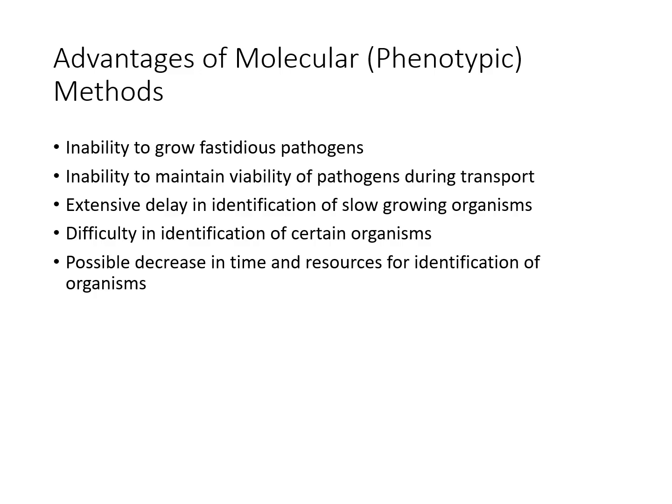Some disadvantages of molecular methods, though, is the cost. It is typically more expensive due to reagents and equipment. Technical expertise, so it requires trained personnel and specialized equipment. There is limited scope, so it usually targets specific pathogens, so it may miss unknown or unexpected organisms.